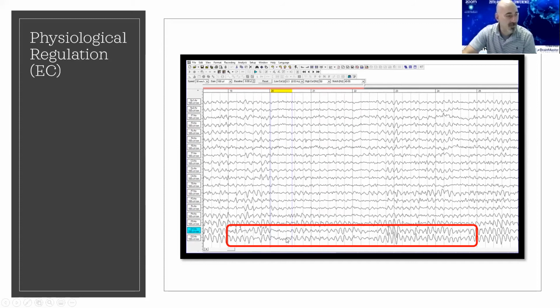And what's happening here is the reticular nuclei stops producing acetylcholine, and the thalamic rhythm drops out. But then it comes back, and we see alpha emerge again, persists along, and then it drops out again. And it comes back, sort of ebbs, comes back, ebbs. And this is a fairly healthy regulation of this process.